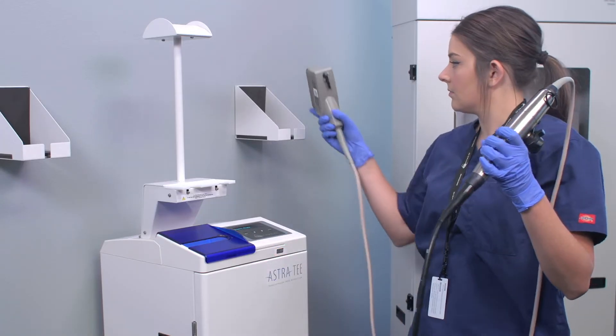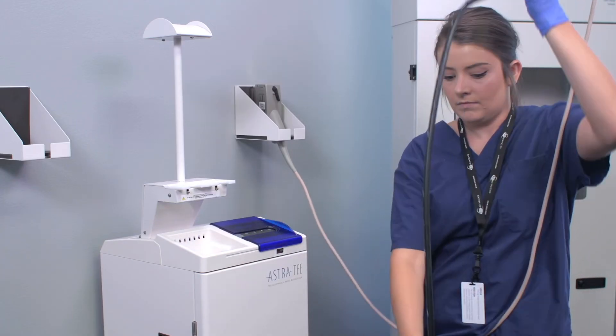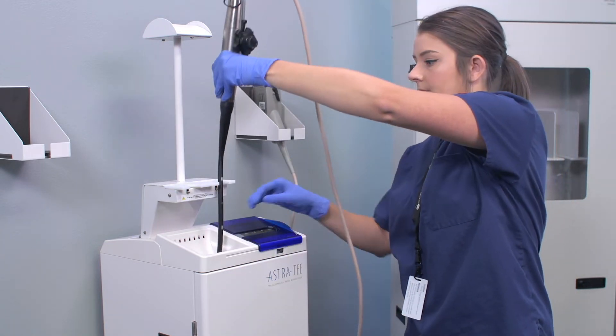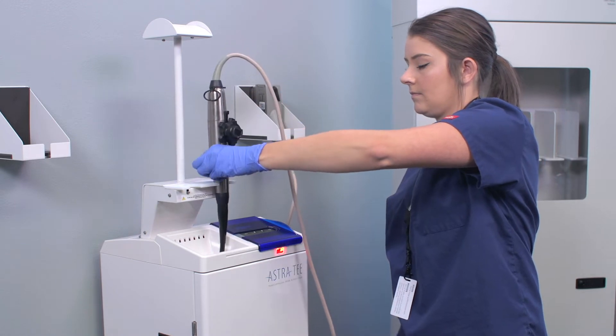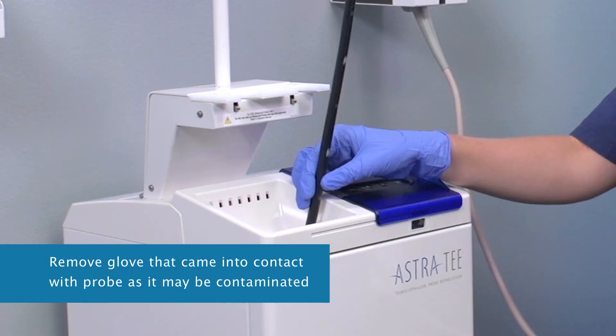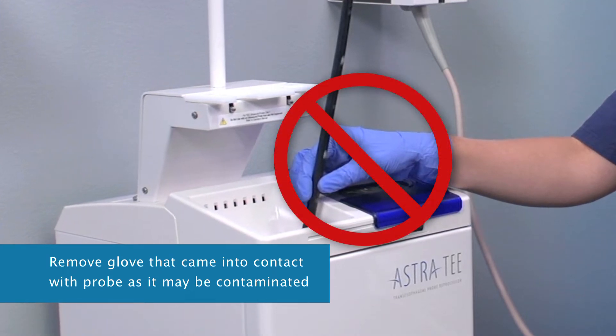The display now reads 'Insert Probe.' Insert the probe into either disinfection tube of the Astra. Slide the probe through your gloved hand in a slightly curved motion and place the probe handle into the holder and the cable over the strain relief.